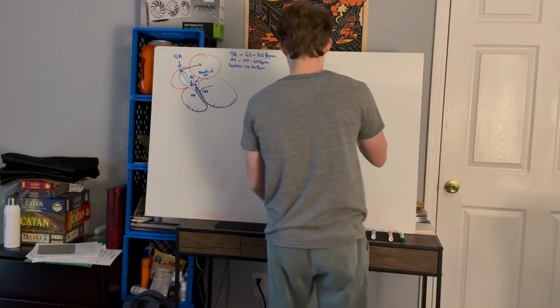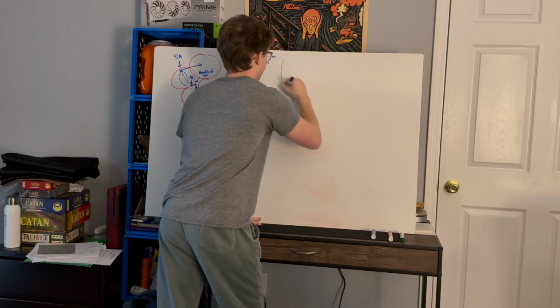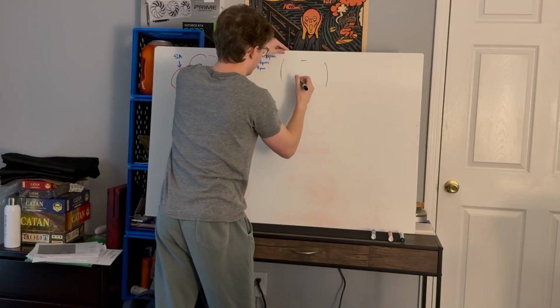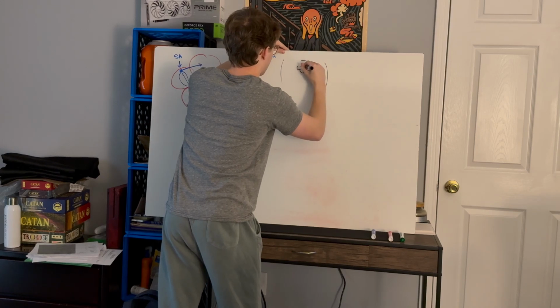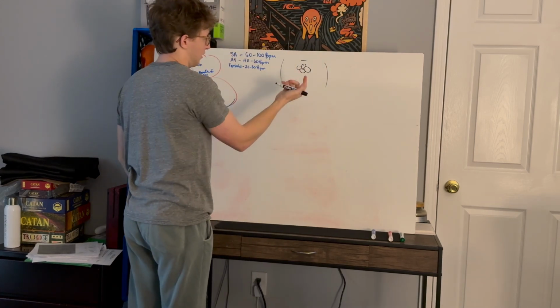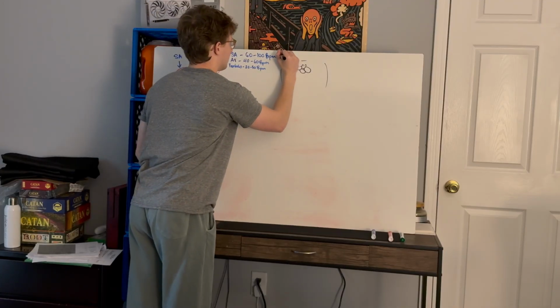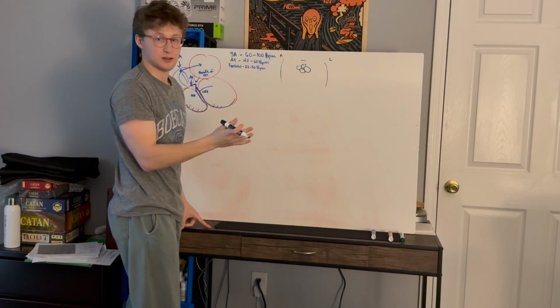So just to draw that out quickly, let's say we're looking at a torso, right? And sternal notch up here. And this is the heart. It's not perfect, but this is the heart right here. This is the right side of the body. This is the left. 10 leads.